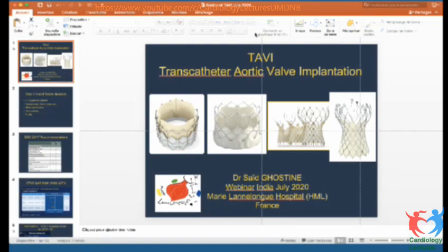I mean, people who have not seen Syed working, he is so meticulous. He does every single thing very carefully, checking. If he is measuring a 6 millimeter femoral artery, he will have a 6 millimeter cover stent, balloon, everything ready. So you expect every single complication, and he goes for it. And like I said, it's just like a routine PCI, like type A PCI. That's the way he does it. And he has gone through a lot of experience over the years. For us, it's easy to learn from his experience and take it, which is more safe, and go for it.